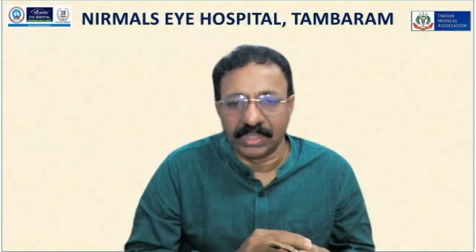So when the CEA, say after 5 years, comes for re-registration, they will ask you about these kinds of documents, the master logbooks, and important statutory documentation. These are called external quality assurance programs. So don't bring NABH into it. NABH standards mention that all government regulations are adhered to by the eye care organization. So that is where the standard implicitly puts it.